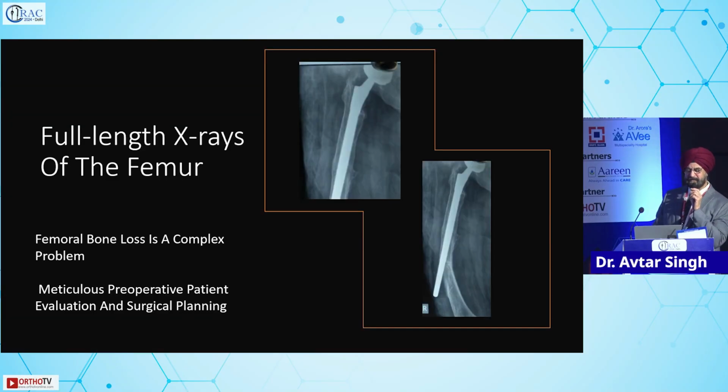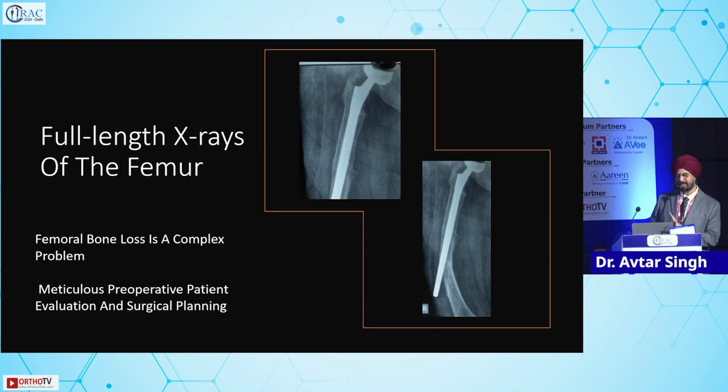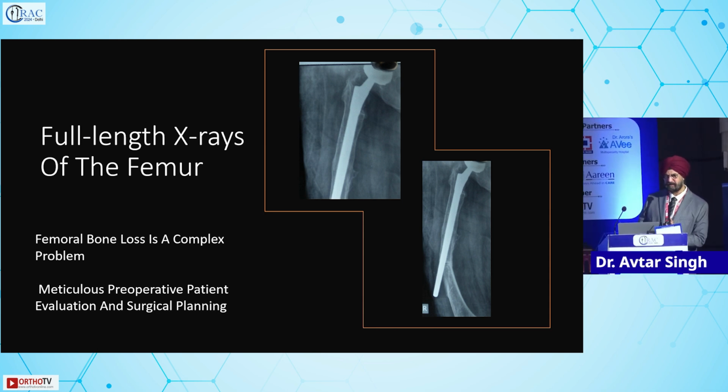So I'll be talking about almost the same situation, the management of femoral bone loss. So friends, managing femoral bone loss is a complex situation. And one most important issue is that you must have full-length x-rays of the femur, otherwise you may end up missing some problem downstairs.